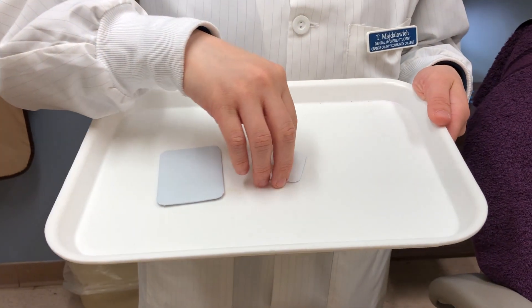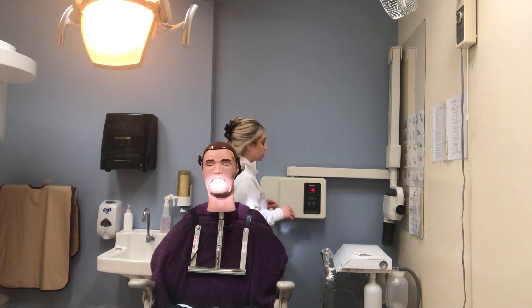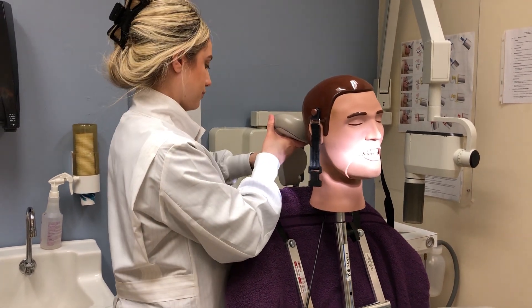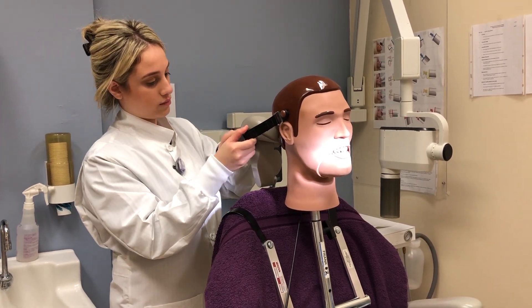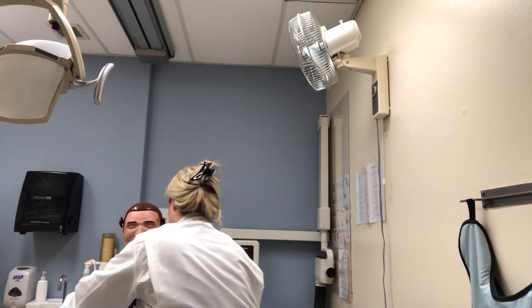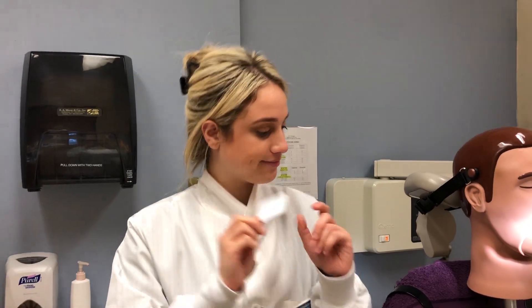For today's demonstration I will be using a size 4 and a size 2 film, and I'm going to make sure that I have my exposure set and ready for the appropriate dentition. I'm going to start off with the permanent dentition and I am going to make sure that my patient is adjusted, the head rest is adjusted — and for the video we are using Dexter, our mannequin. We're going to go ahead and make sure that they have their lead apron on for protection, and the light is optional — I like to use it. Let's begin.